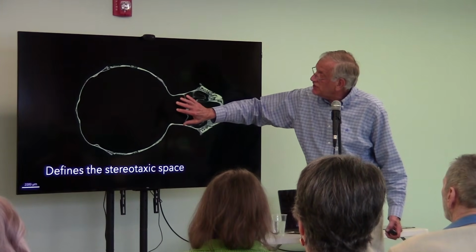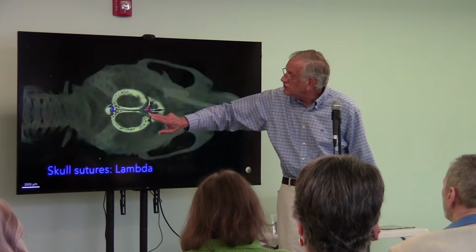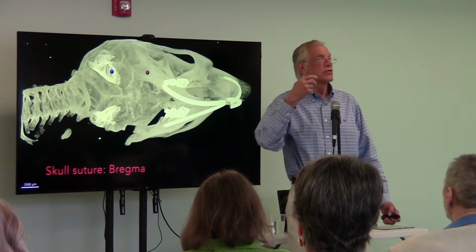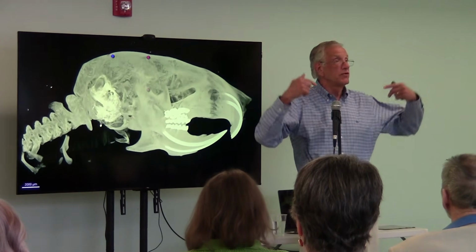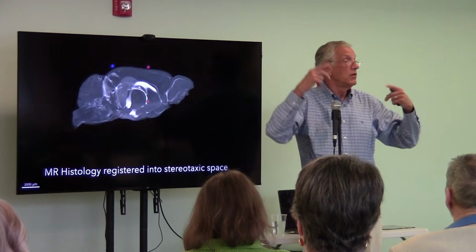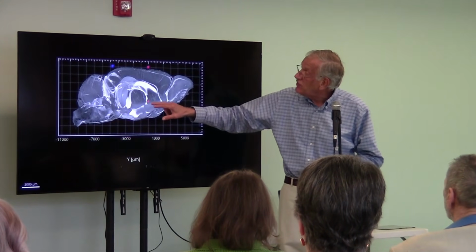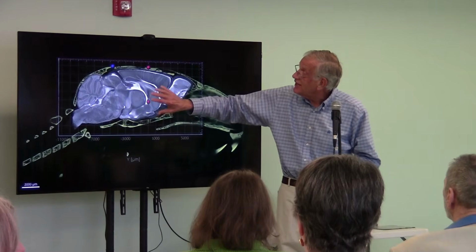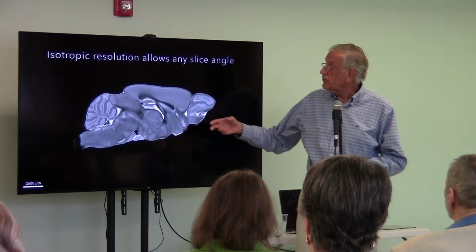This is a micro-CT through the skull, primarily to get to these little sutures at the top. Those are external landmarks. So if you are doing external studies, if you're doing stimuli of a mouse, you can have a reference frame. We have colleagues over here at UNC that do functional MRI, and we have now put our MR data into that, so we have external landmarks and internal.